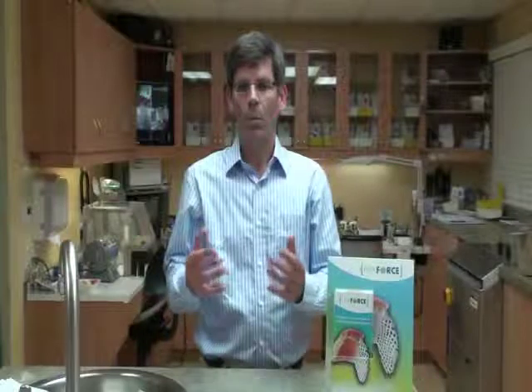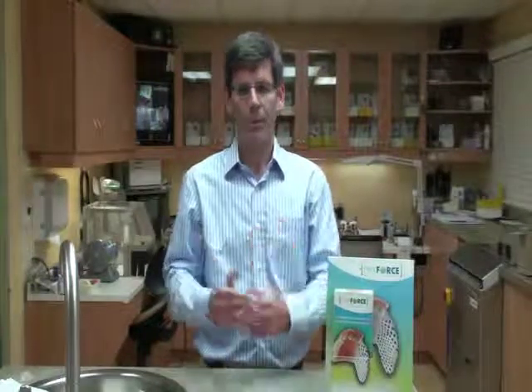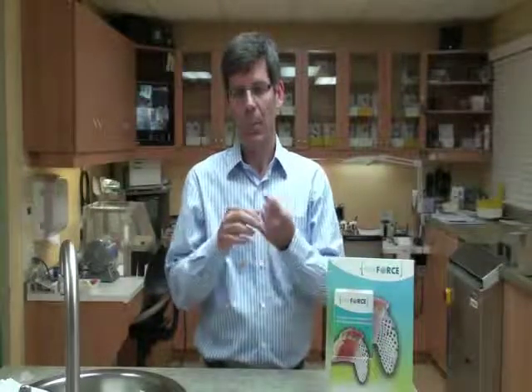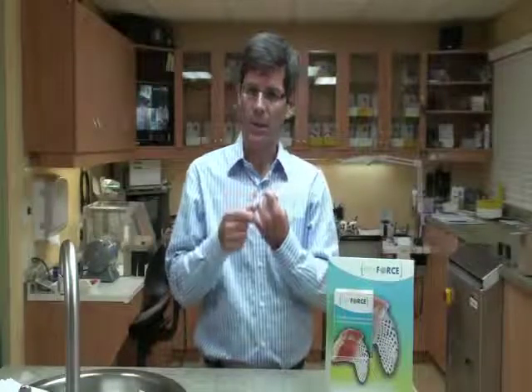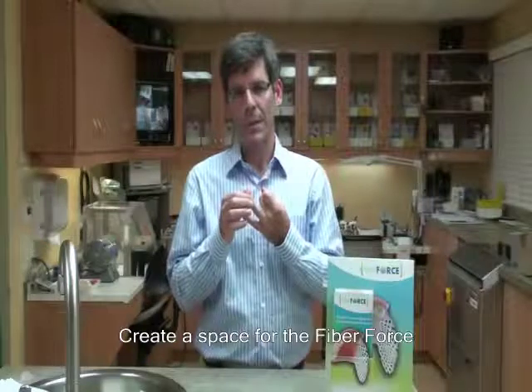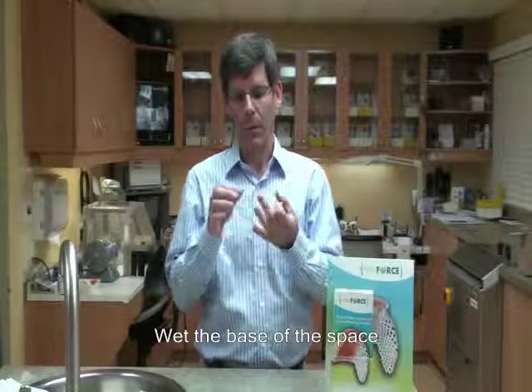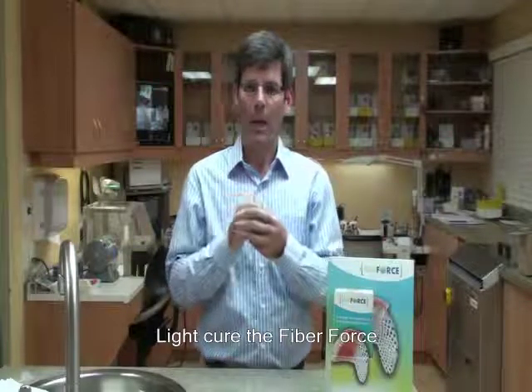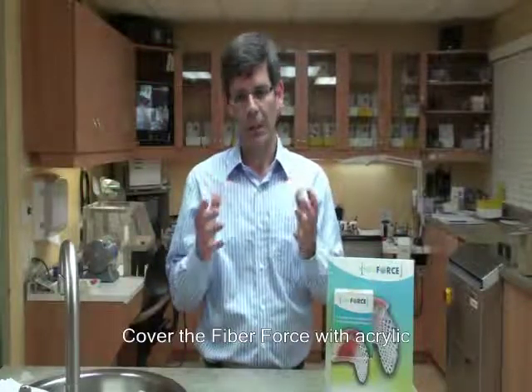The actual repair technique will vary depending on what type of resin or acrylic you decide to use, but there are four basic principles you want to respect in any case. Number one: you need to create a space for the Fiber Force. Number two: insert your Fiber Force into a wetted base of material. Number three: you have to cure the Fiber Force. And number four: you want the Fiber Force completely covered. These four principles need to be respected in all repair situations.